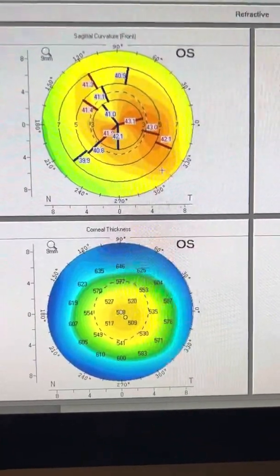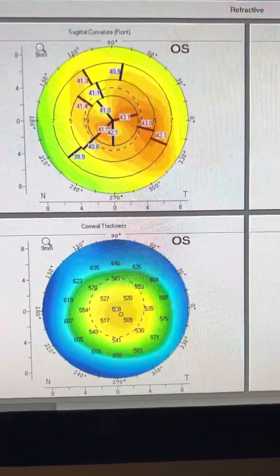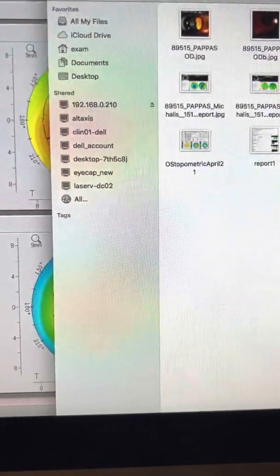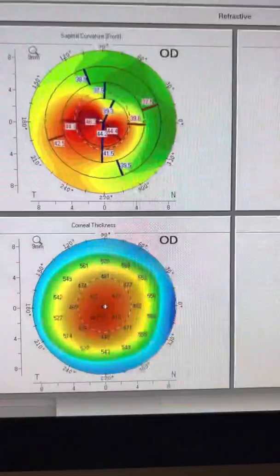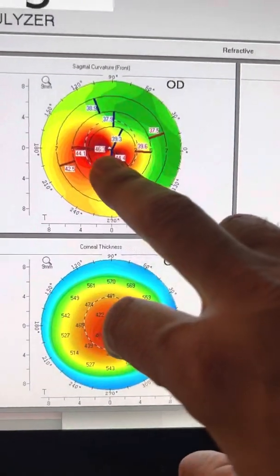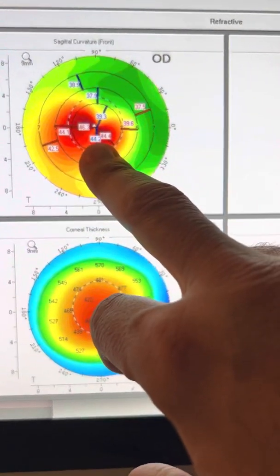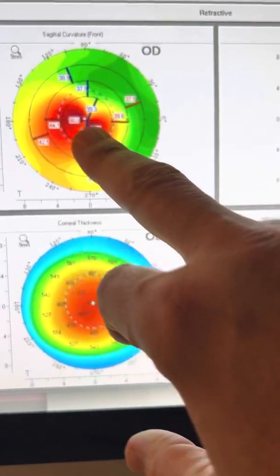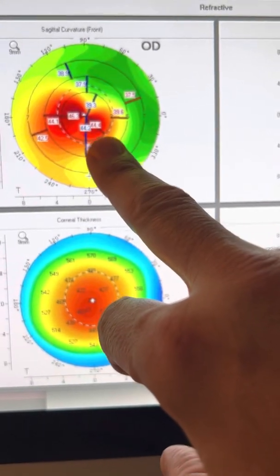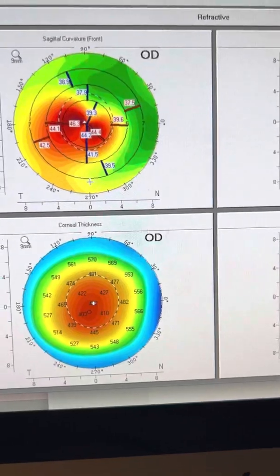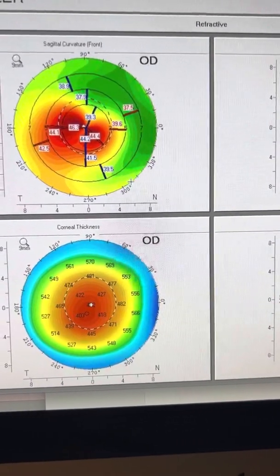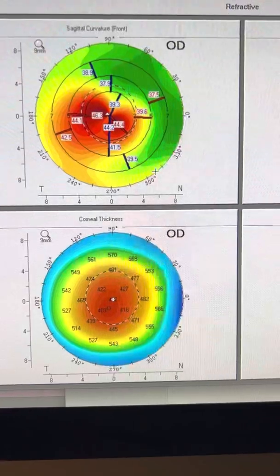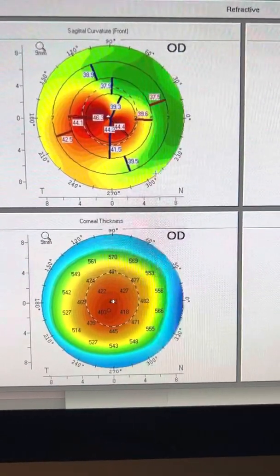By the way, the patient is 20/20 in this eye and is 20/30 minus in the right corrected eye. But what we expect to see here is with that epithelial scar retreating, that this central steepness may subside. And the actual flattening that we saw before, that was about three diopters in sagittal front curvature maps, maybe more.